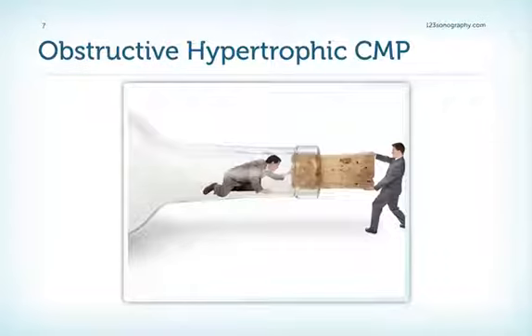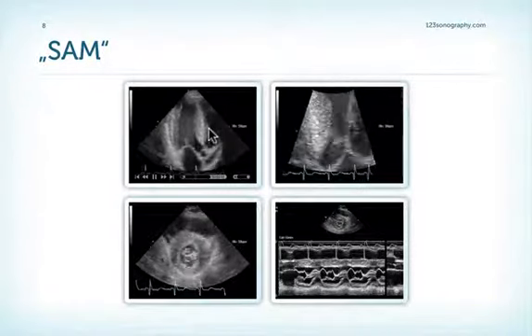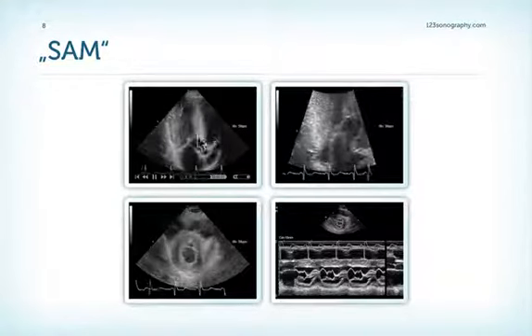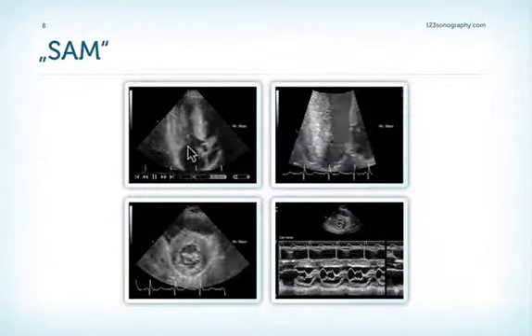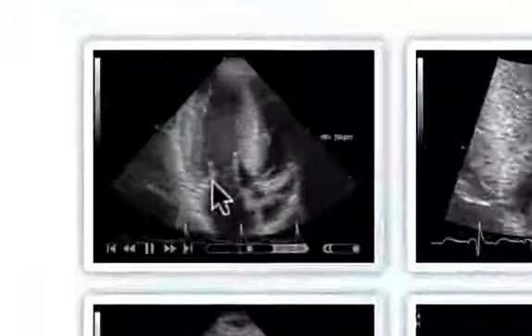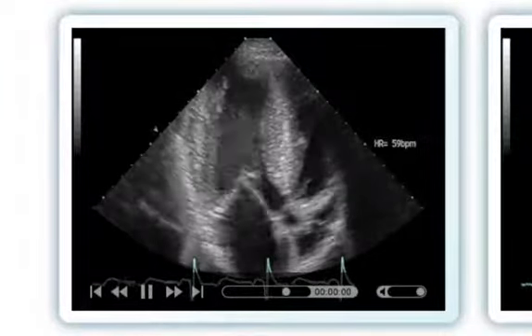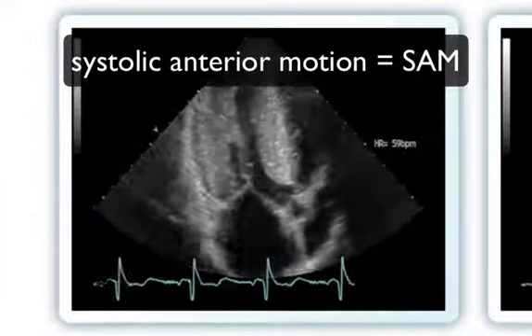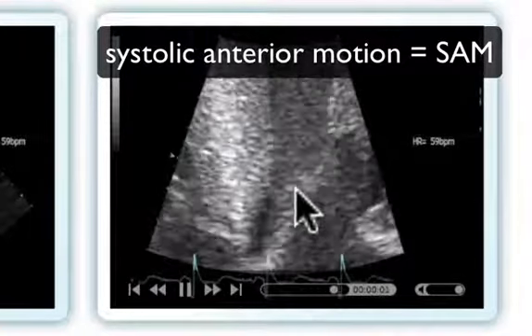Now let's look at the typical features of obstructive hypertrophic cardiomyopathy. In these 2D images, the patient first of all has massive left ventricular hypertrophy — again more of the septum than the remaining portions. But in addition, the patient also has a very abnormal motion of the mitral leaflet, in particular the anterior mitral leaflet. During systole, this leaflet is dragged towards the septum and thereby obstructs the LVOT. This motion is called systolic anterior motion, and it can be seen in the apical long axis view, where the obstruction by the anterior leaflet is very nicely visible.